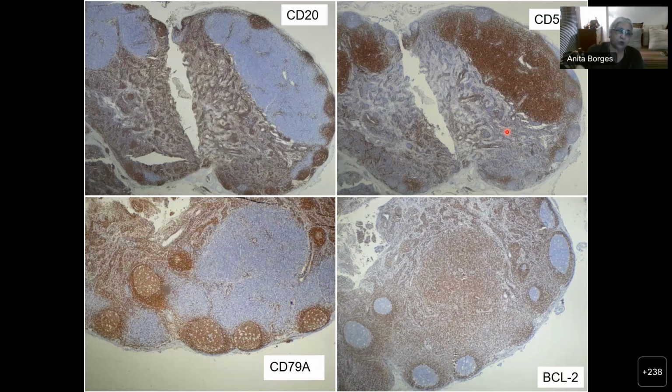All right, now you can look at the same thing in CD79A. CD79A and CD19 are markers that we don't use very routinely in our lab, but we have it.